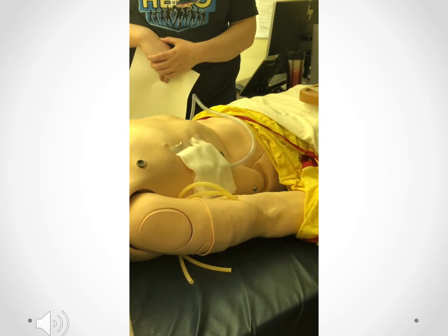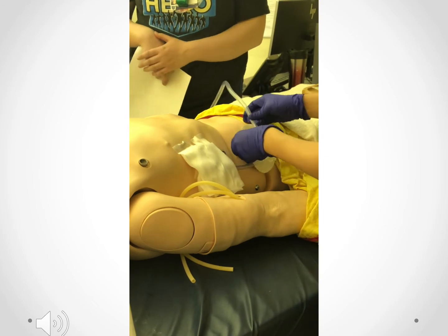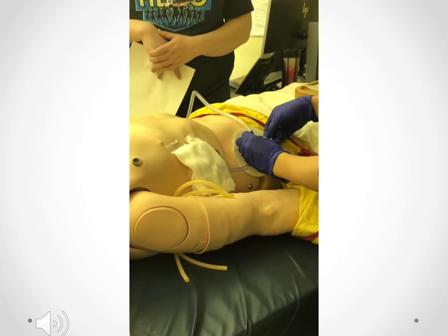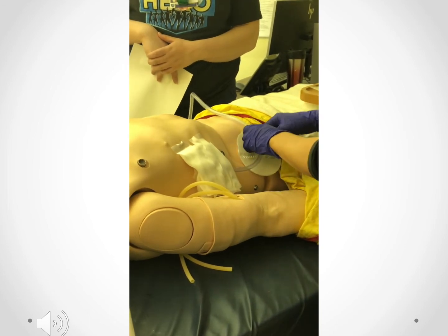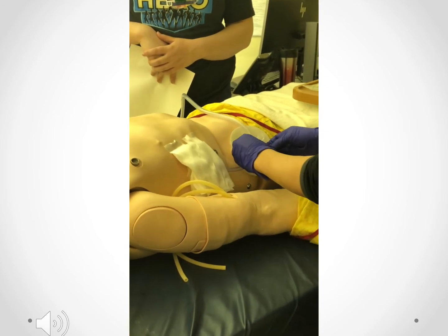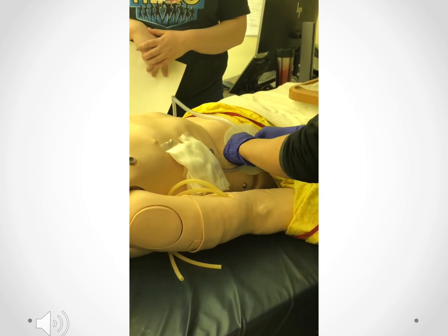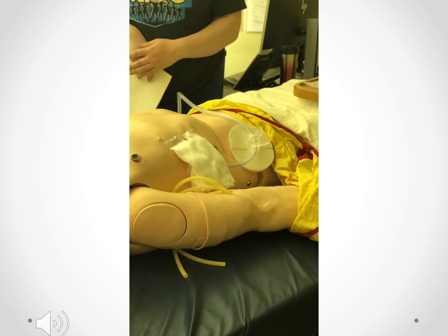And then we can use our securement device to hold the tube in place to provide more comfort for the patient. And that's our chest tube dressing.